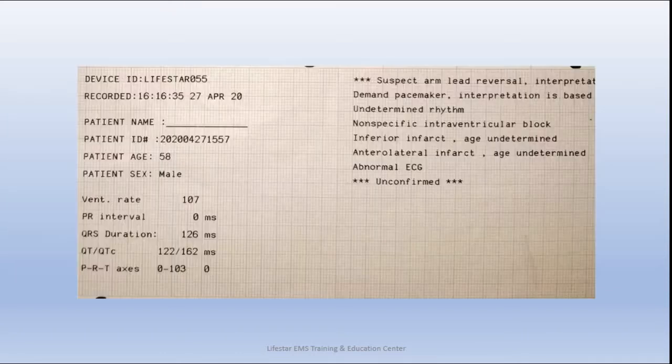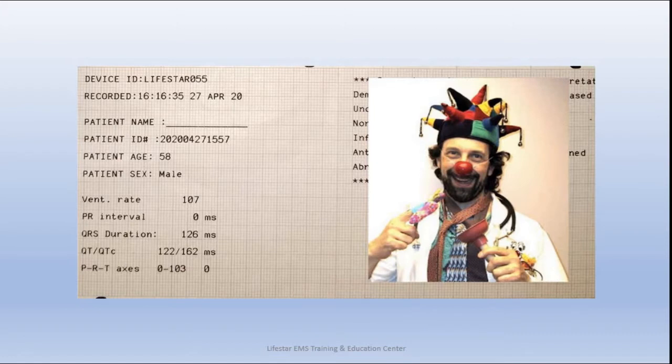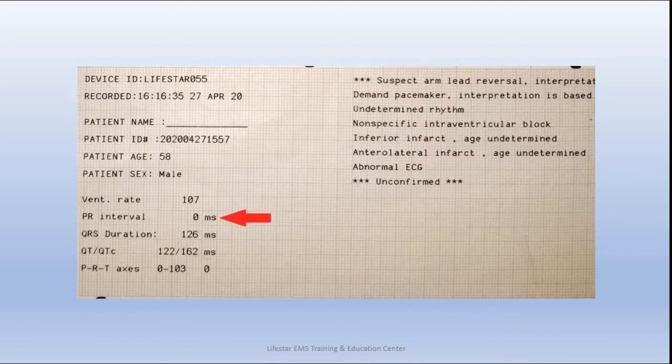Now, when I read a 12 lead, I go through the same process from beginning to end every time so that I don't miss anything. I have this muscle memory from practice. I read every 12 lead the same way beginning to end, and I start here. Not the doc in the box part, because I don't like the doc in the box and he's frequently wrong. I'm talking about over on the left side down here.